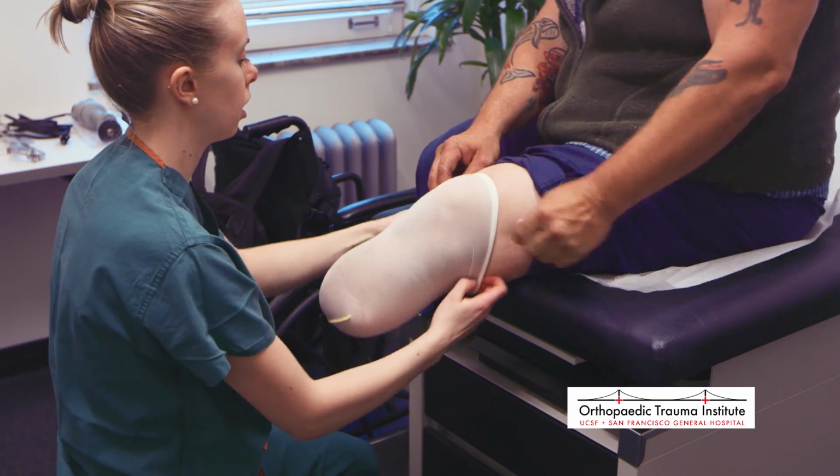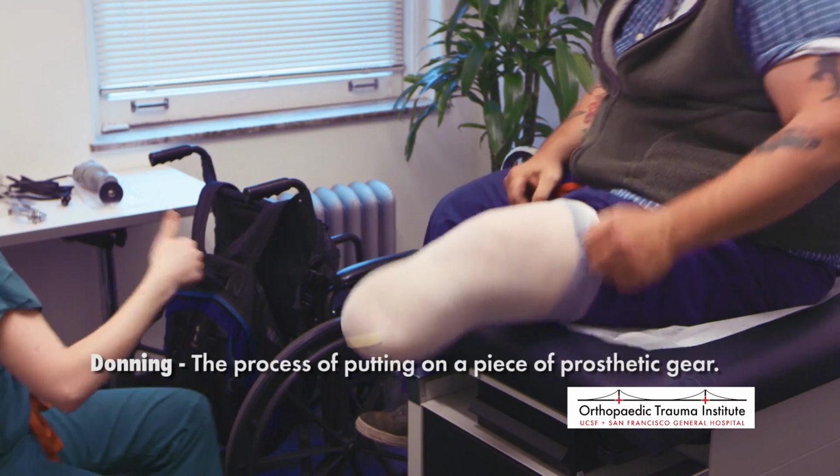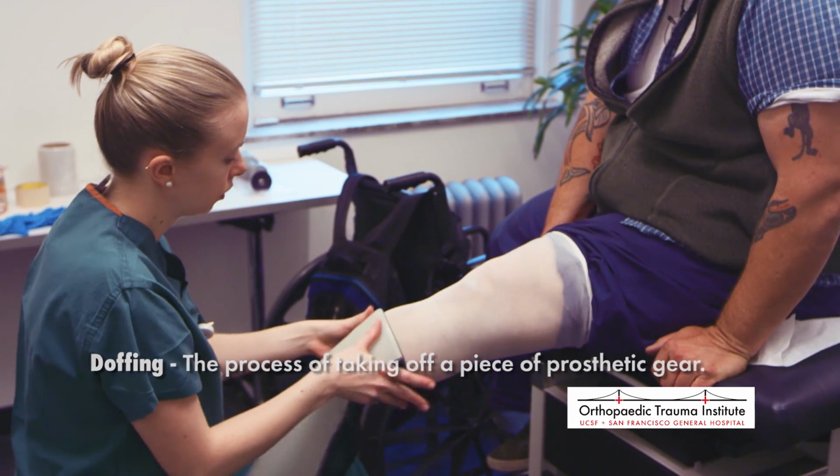The process of putting a sock or liner on your residual limb is referred to as donning. Conversely, removing a sock or liner, as seen here, is referred to as doffing. These terms will be important to remember as they are frequently used.